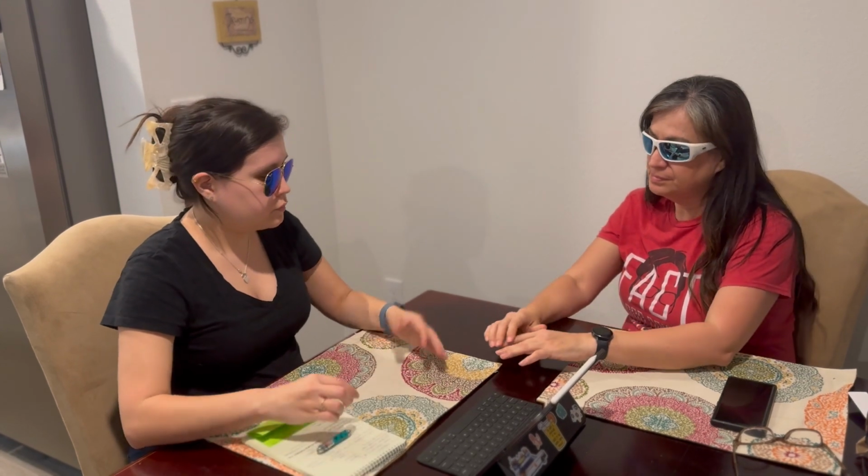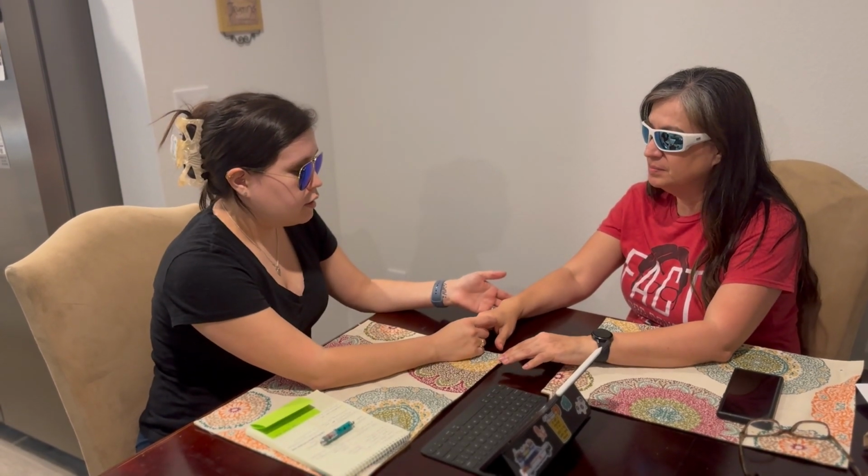Remind me, was this in your wrist that you were having pain mostly? Yes. Okay, perfect. So then let me go ahead and set this timer. And is it both wrists, or just one? Both. Both? Okay. So we're going to split it, 5 minutes and 5 minutes between both. If you'll go ahead and take off your watch, just so that I can access the area that's bothering you the most.